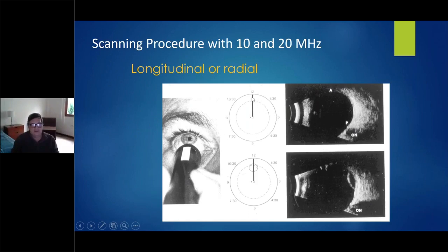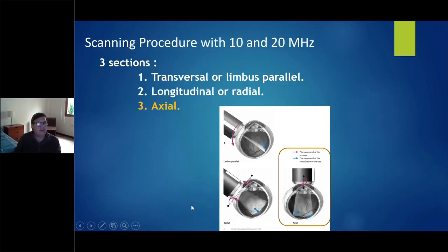When in the scan, the superior part is always anterior and the inferior part is always posterior. And you can see a retinoschisis, a tumor or whatever in this position. And at the last part, we can make the eye examination.